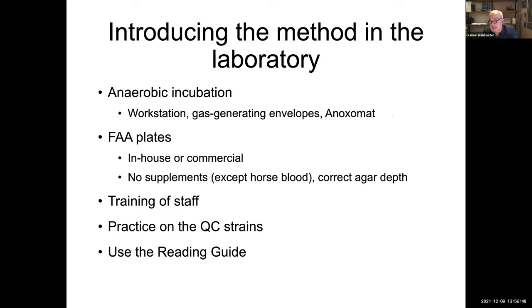Yeah, I think that we don't know exactly for all of the 16 labs, but most of the 16 labs that were participating in the field trial were just standard clinical microbiology labs. Some of them have an extra or additional interest in anaerobic bacteria, and some might have some reference functions in anaerobic bacteria, but not all of them. So I think they were mainly just standard clinical microbiology labs, but most of them have experience in disc diffusion of other organisms.